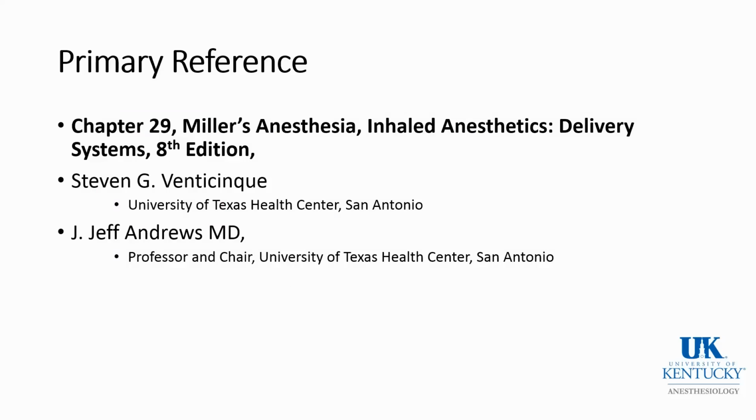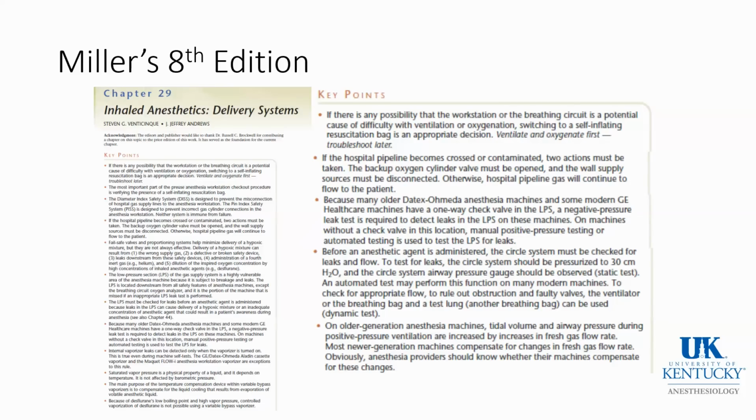Now, the primary reference in this podcast is chapter 29 from Miller's textbook, 8th edition. And I highly recommend that you read this chapter. There are a very large number of key points, and I've emphasized a few of them on the right-hand side of this slide. And the number one key point is to have a resuscitation bag and source of oxygen available. Believe it or not, this was not universal 20 years ago.